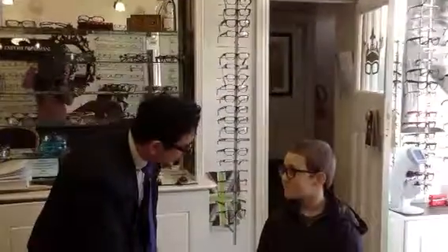You've got Christmas presents to open — and how annoying is it when your child's glasses are slipping? It's more than just annoying. Sometimes when you have a lazy eye and you're looking over the top of your glasses, it's actually detrimental to your eyes. So I'm going to teach you a really quick way of tightening glasses, and this is a basic one.